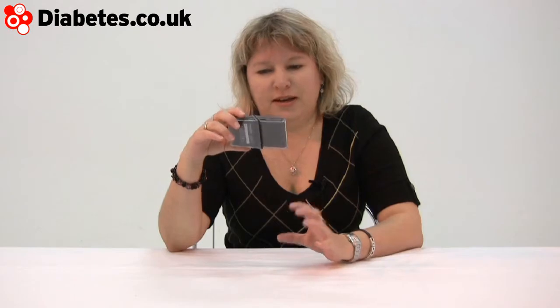Hi, this is the Discreet Meter by Mendor, looking to all the world like a shaver. This is coming up blood testing from quite a different angle. It's got all the normal bits, but it's all in one place.